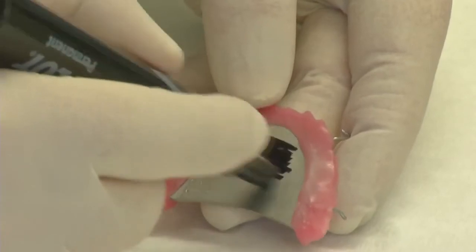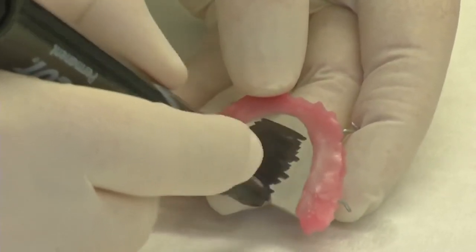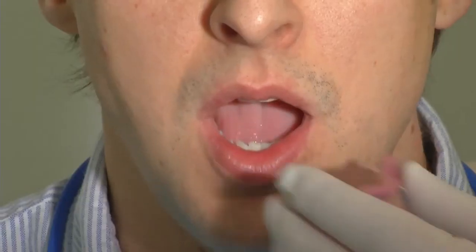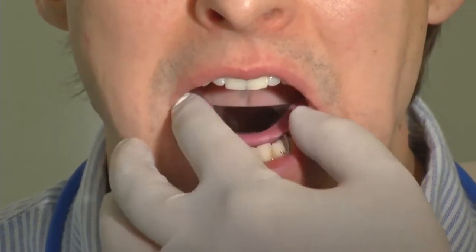The patient is then asked to move his mandible to the left and then back to the center, and performs the same movement on the right side two to three times. This exercise is to prepare the patient for the actual bite registration procedure.